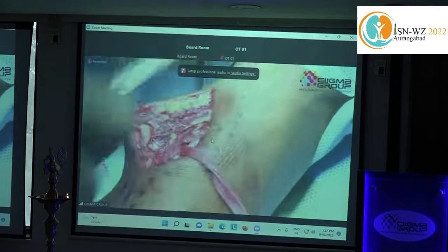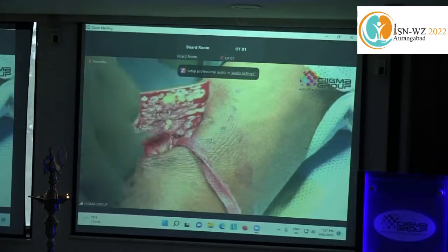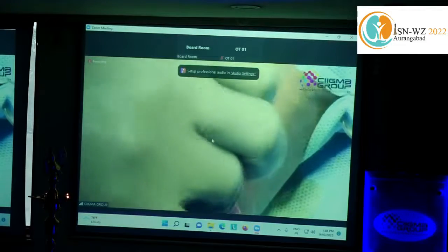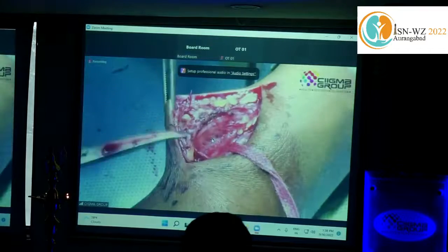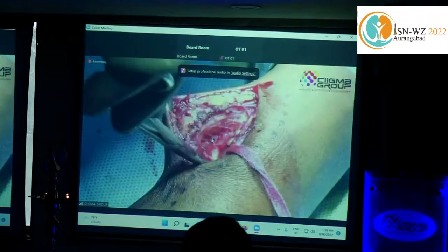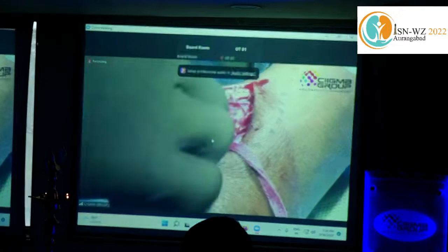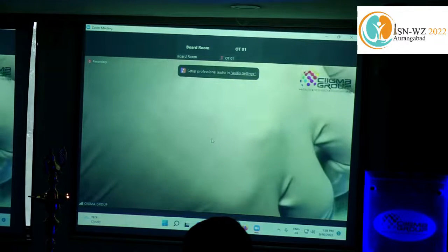Now I will go in this plane and get rid of the surrounding tissue with ease. In this plane, as I showed you during the anatomy of that particular area, this is the retinaculum. It is like a small paper just overlying the artery. So always make sure not to damage the artery, which is just lying below this. This is the retinaculum. So now you can palpate the radial artery here.